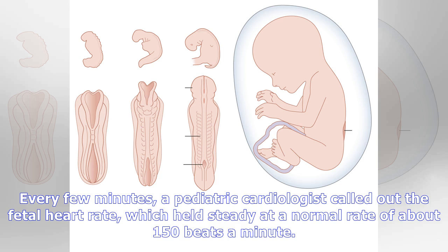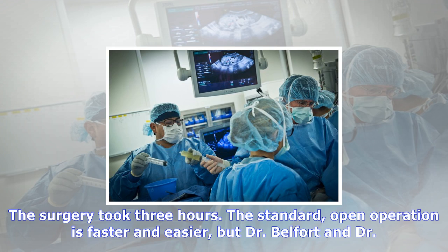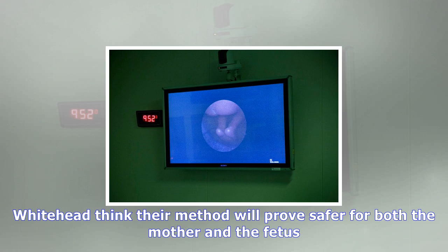They gave the fetus an anesthetic injection and then, guided by images on the video screens, began to operate on him, tugging skin and membranes over the naked spinal cord and sewing them tightly shut with 5 stitches to seal out amniotic fluid. Because the defect was so large, they made relaxing incisions along his sides, to loosen the skin so they could pull it across his back. The cuts would heal, though they would leave scars.